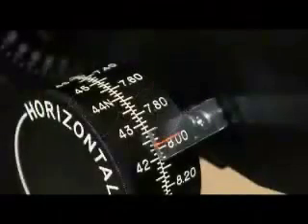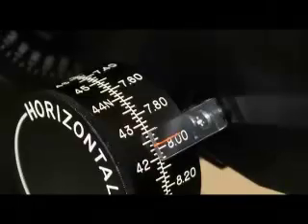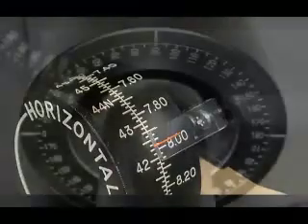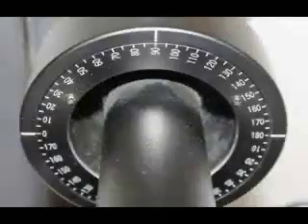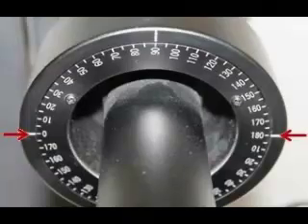The scale of the horizontal measuring drum indicates the dioptric power of the cornea along the horizontal meridian. The meridian indicators on the axis scale are white lines. Horizontal axes fall plus or minus 20 degrees around 180.